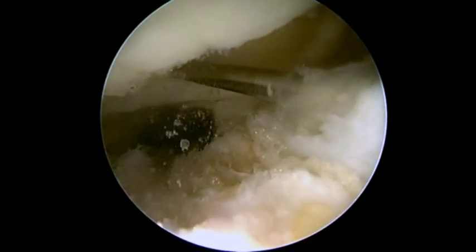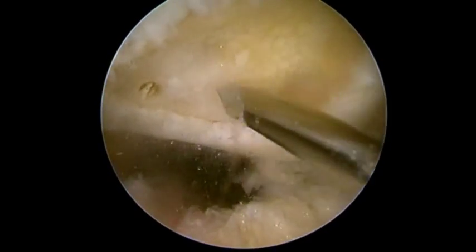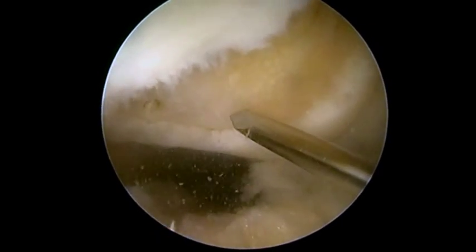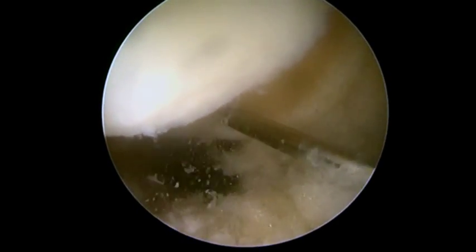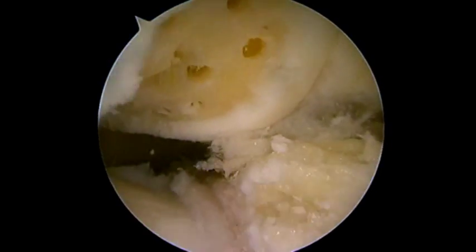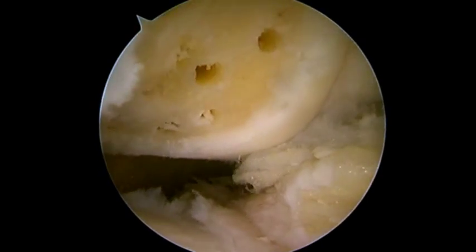After you have smooth, stable edges and a clean base, you can now perform a microfracture, which may be performed in a variety of ways. Here we use a small K-wire, and you could also use the Arthrex PowerPick. These are favored over the standard awl technique based on the characteristics of the vents produced. It can be helpful to have an assistant use their thumb on the opposite side of the patella to perform counter pressure.